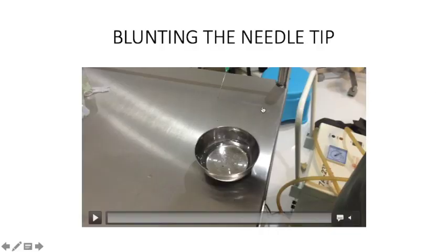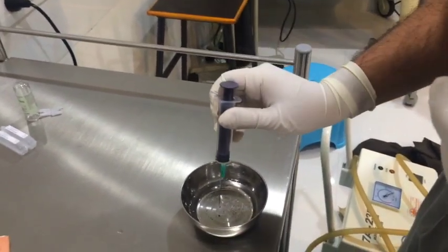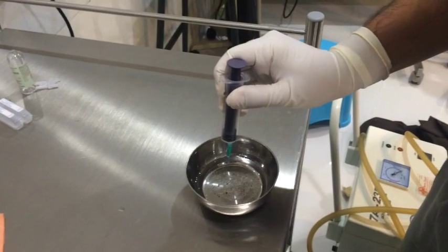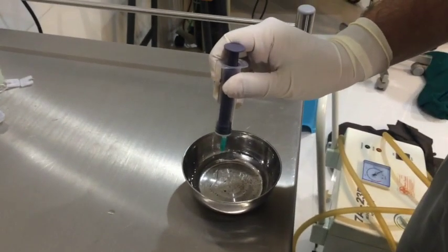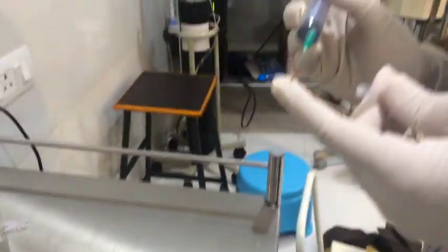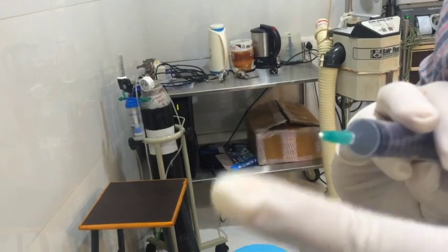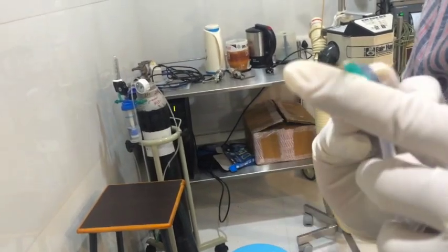So how to blunt the needle tip? It is very simple. This is a bowl of the local anesthetic, and I will hit the needle twice or thrice to blunt the needle tip. So here you can see this is the LA bowl, and I hit the needle twice or thrice, and my needle tip has got blunted. So this is how you can blunt the needle tip.